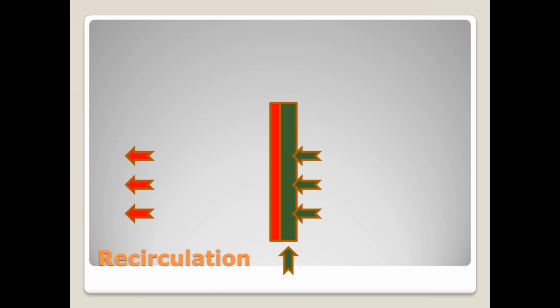So I am draining from the right jugular, which is 21 French, and from the left femoral, which is 21 French, and giving return to the right femoral, which now goes to the RA instead of the hepatic IVC. So you are getting deoxygenated blood from here and here, and supplying oxygenated blood to the RA directly.